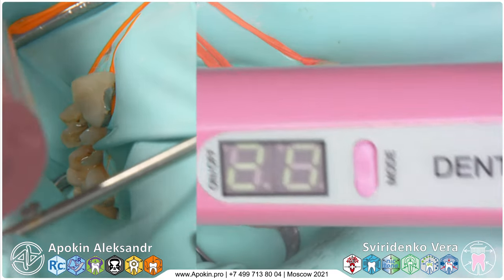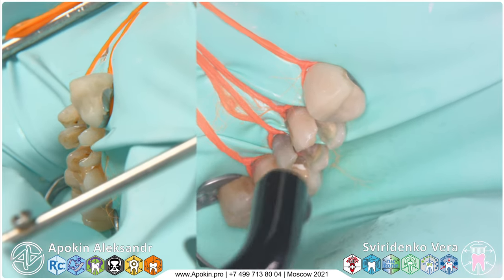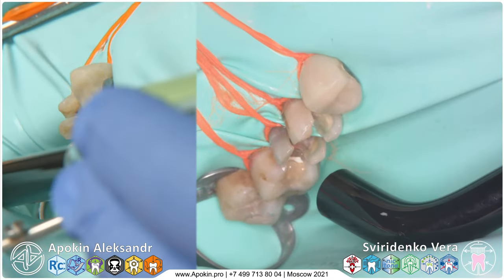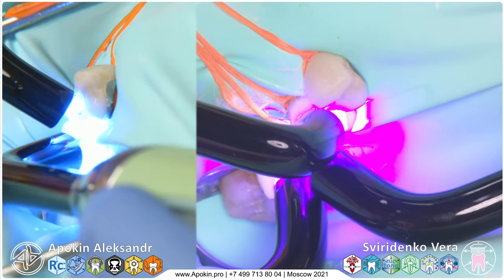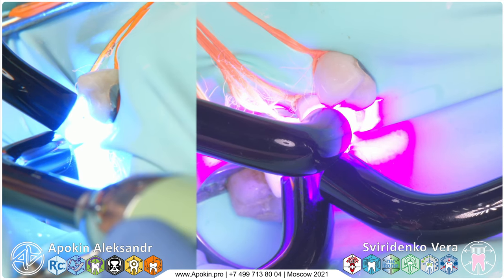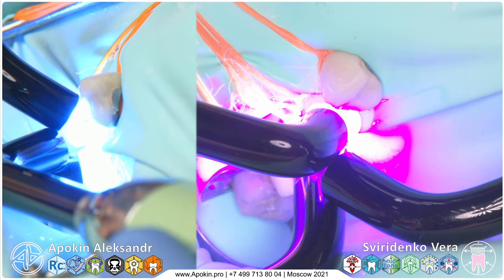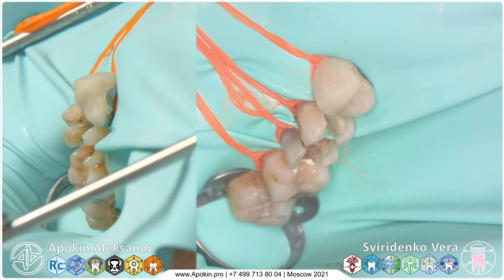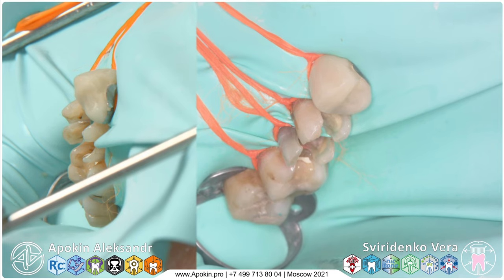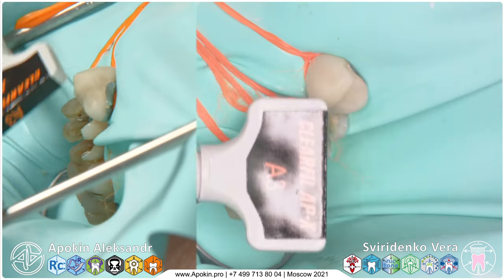We set 20 seconds on our curing light. I'm starting with the curing. And we are prepared and ready for our main part, working with interdental section matrices, the fixation, and working with composite. As we started with Kuraray, so we continue working with Clearfil APX, also from Kuraray.